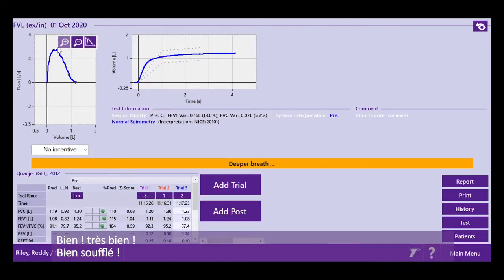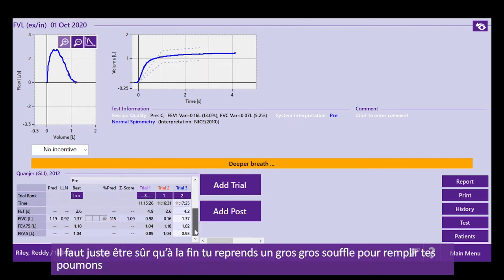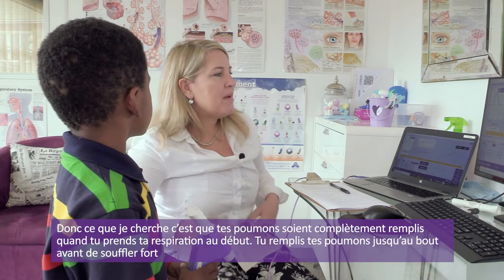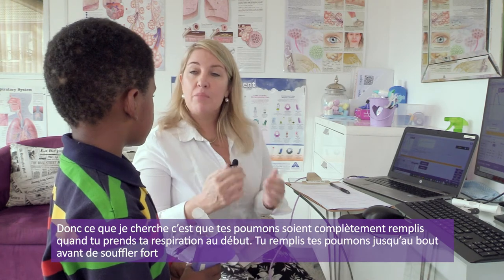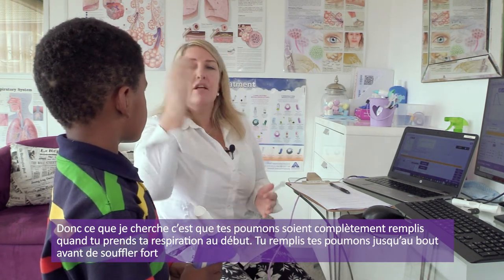Okay, so that was a very nice blow. Very tall and strong. Can you see that? I'm happy with that. I think we just need to make sure that you breathe in completely to fill your lungs at the end. So what I want to make sure is that your lungs are very, very full before you start. Okay, so make sure your lungs are full before you blast the air out. Okay.